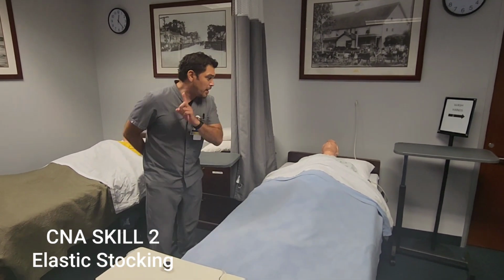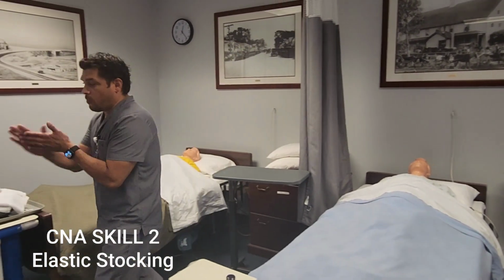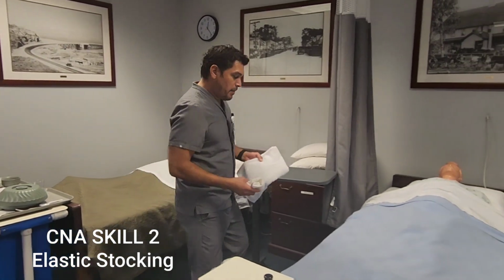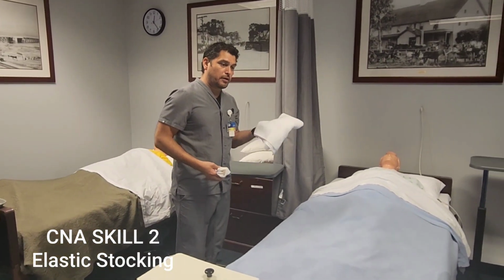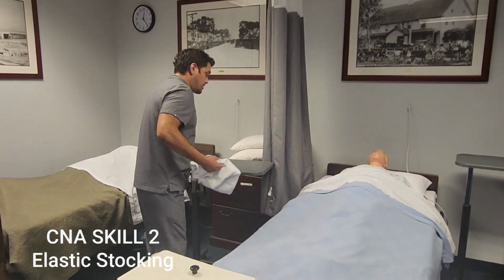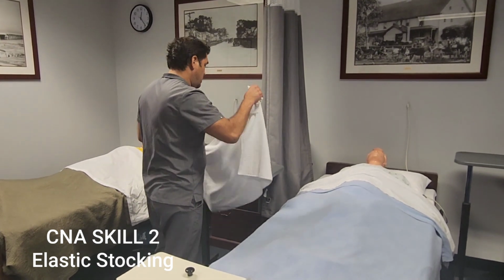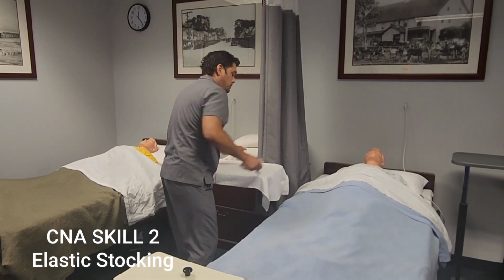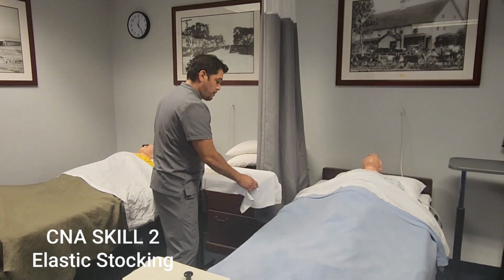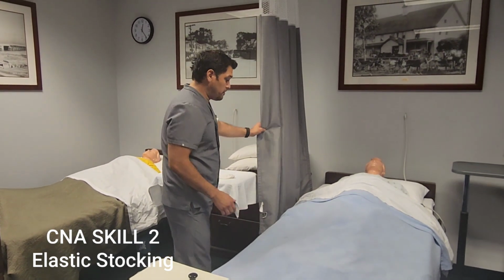Real quick, I'm just going to get my supplies and I'm going to wash my hands, okay? I'm going to go wash my hands. I'm going to gather my supplies. My supplies are going to be one barrier and the TED hose, okay? I see that they have their bedside table right here, Mr. Jones. I'm going to go ahead and place the barrier on the table so I can put my clean TED hose on top of the barrier. This way I can go ahead and close the curtains for privacy.